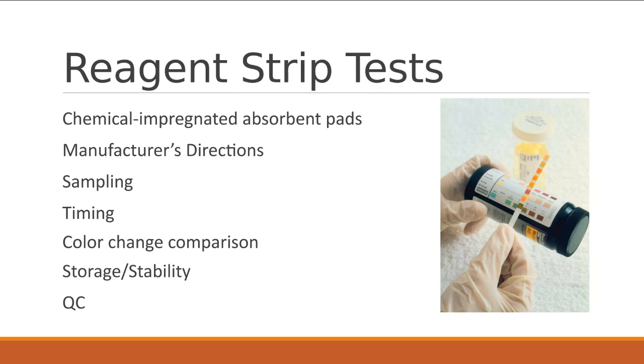You don't want to touch the pads, okay? So when you take it out, make sure you hold it on that end, kind of where this person's fingers are at, so make sure you do that. And we're going to QC them. Whenever we use them, we're going to QC the bottle. So that's something that you'll be doing every lab.